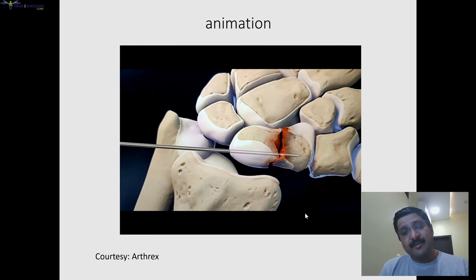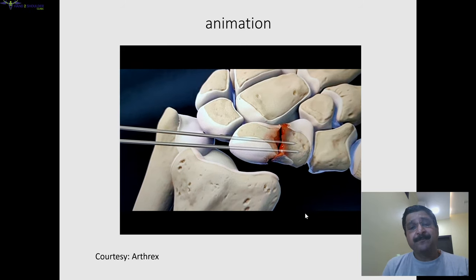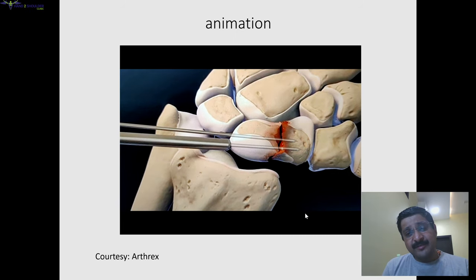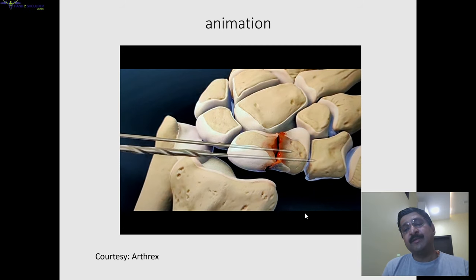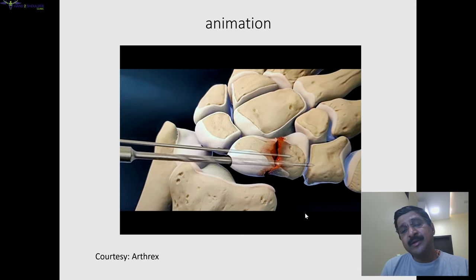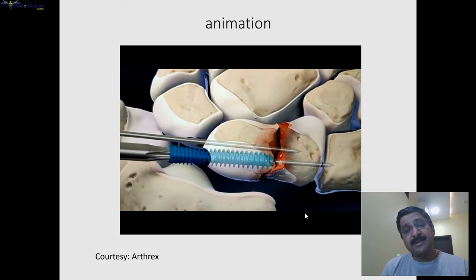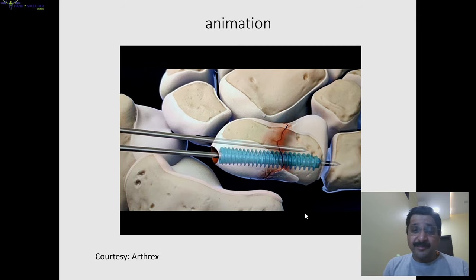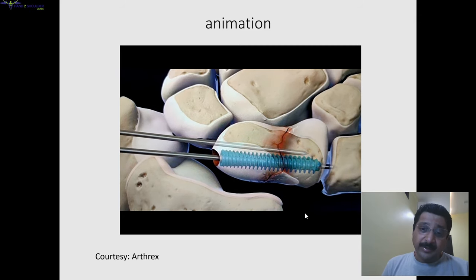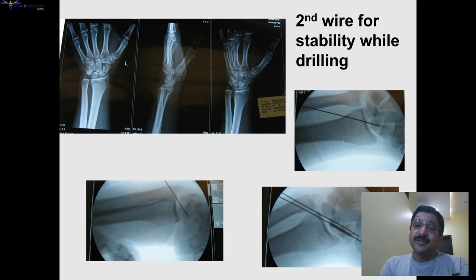By animation we can see: at the fracture site, we pass in a guide wire, then pass a second guide wire to prevent rotation. We then measure the length of the screw. Once measured, we advance the guide wire further so it doesn't come out during drilling. We drill to the desired depth and pass in the screw. With a differential pitch screw, tightening causes compression at the fracture site.